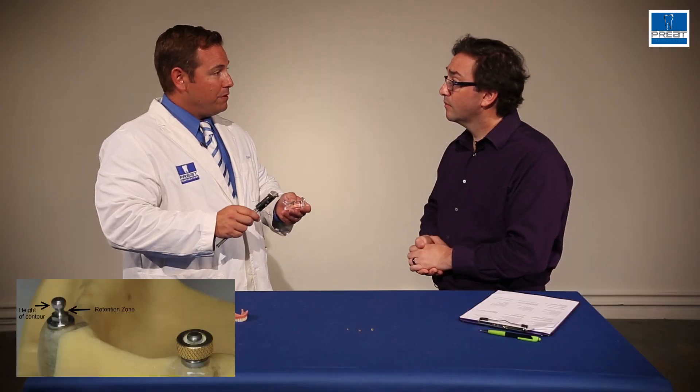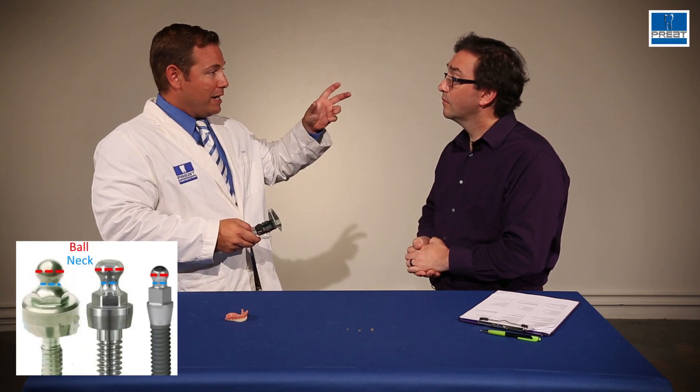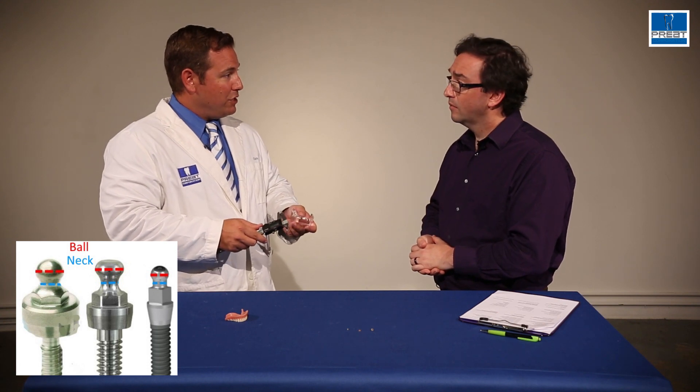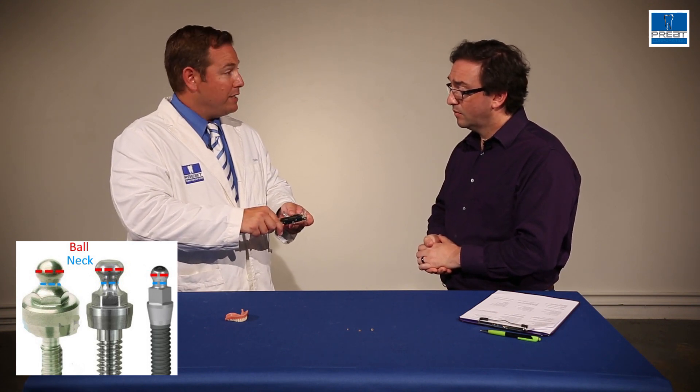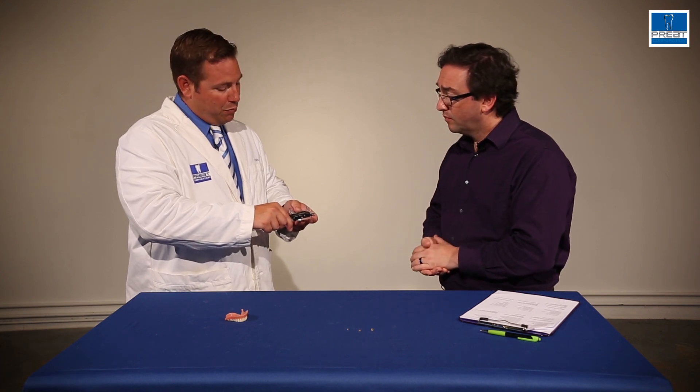In general, there's about a 0.4 to 0.8 millimeter drop between the height of contour and the retention zone. So if we measure a 1.4 retention zone, our height of contour — which is the diameter of the ball — most of the time is in that 1.8 to 2.2 millimeter range, which is what keeps the O-ring down. This one is a 2.15. So if you had measured a 2.15 diameter ball and said, I need an O-ring for it, I would do that math — 0.4 to 0.8 — and know something in that 1.4 range would be ideal.